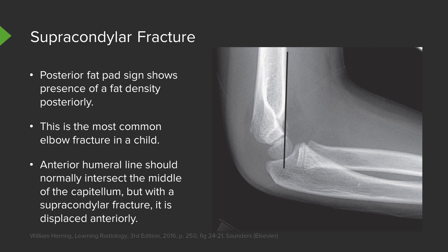Another way of identifying a supracondylar fracture is to draw an anterior humeral line. This line should normally intersect the middle of the capitellum. As you can see here, this line actually intersects the anterior aspect of the capitellum, indicating slight displacement, which is another way of looking for a supracondylar fracture.